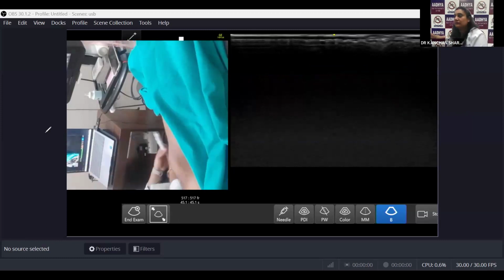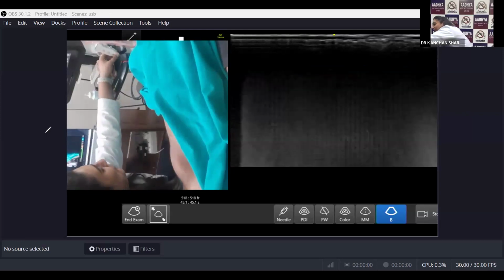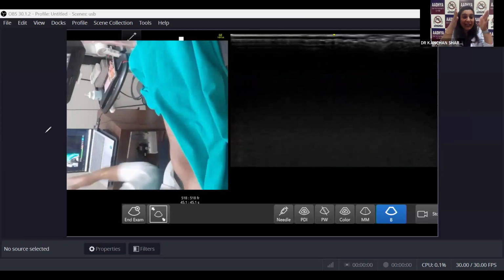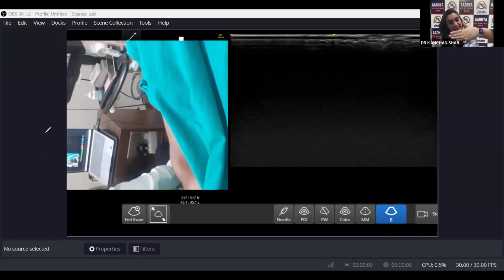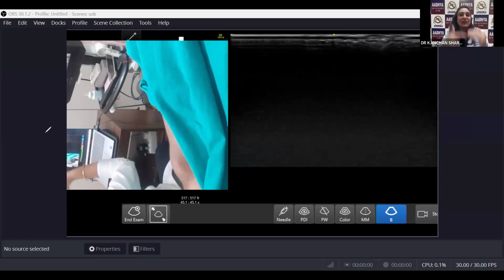No answer. Sorry, Doctor, I was not following. Sorry. So I'll do one thing. Let us finish the lateral side, then I will show you. I think that will be pretty clear to you because I cannot go much on the lateral side today. So I will show you where exactly your lateral iliotibial band in the short axis will be, and how you are going in the short axis and where your recess will be, because that will be a little up. We will not be piercing the iliotibial band to go to the recess.